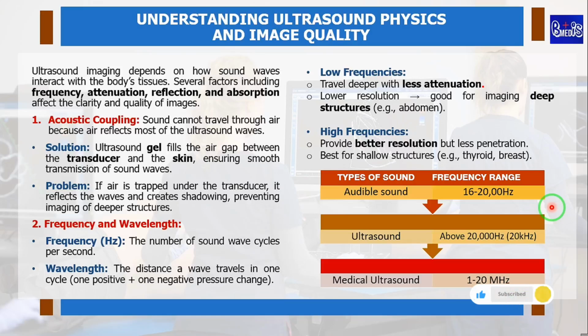Okay, so let's now take a look at understanding ultrasound physics and image quality. Let's look at image quality.